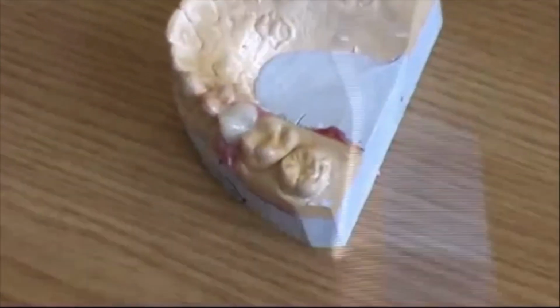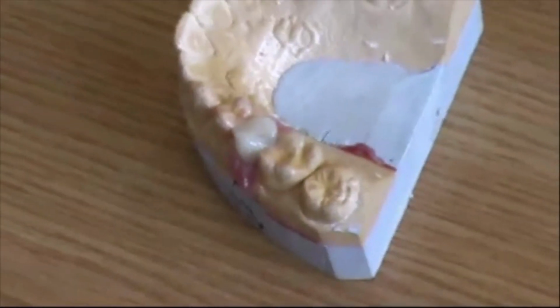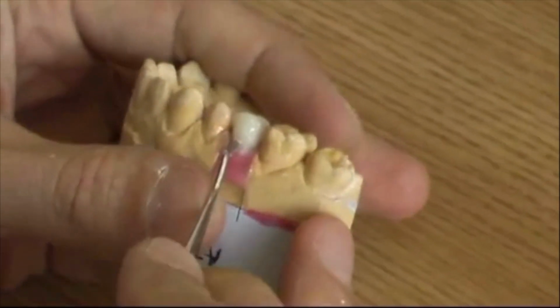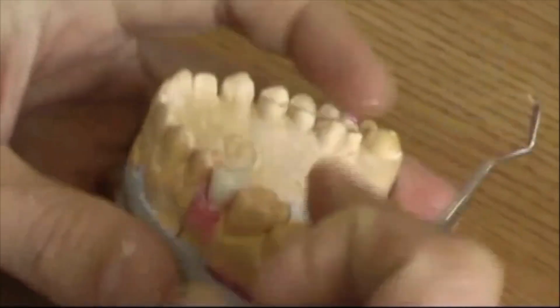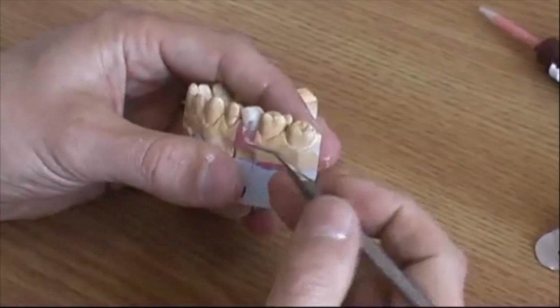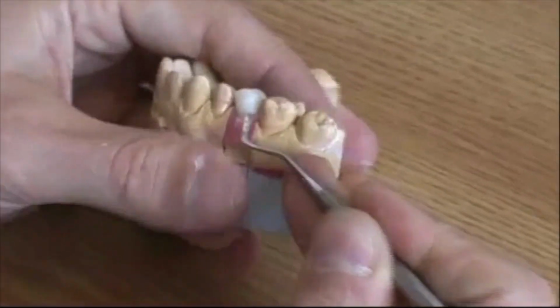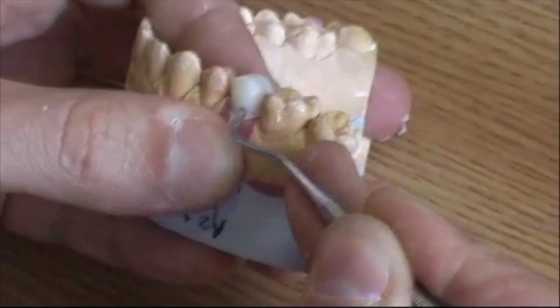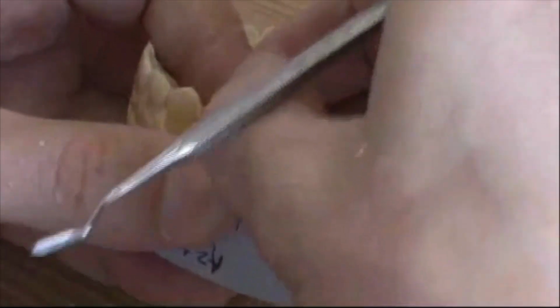So that's the crown. So nice. So nice at the margins. Of course, because I had such a wonderful index material. And now slowly you take it off from the model. Just imagine and remember, we are in the mouth now. Yeah, we are on a model, but we act as if we were in the mouth.